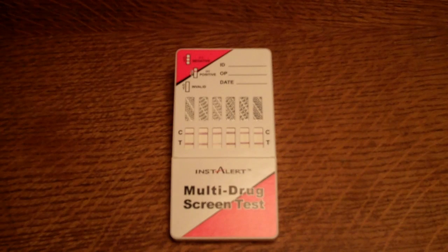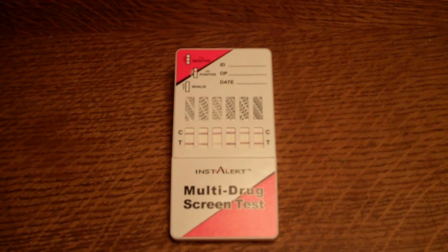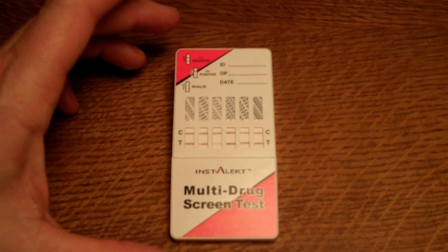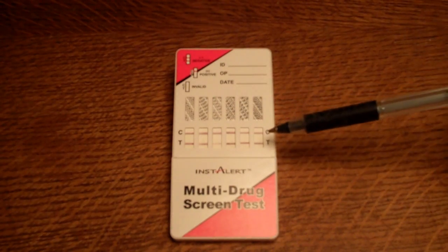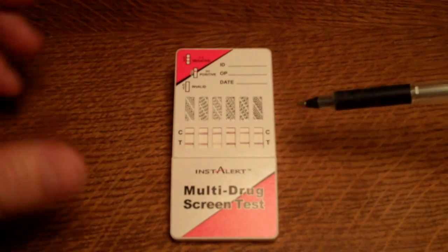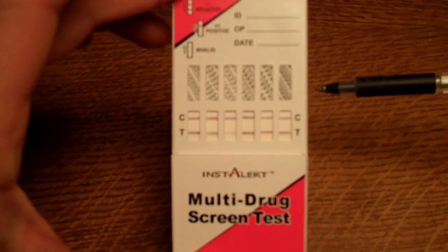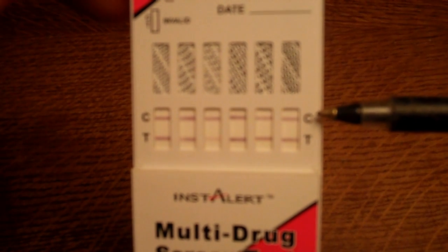In this video we're going to give you instructions on how to read the results on a multi-panel drug test. This covers a very common question we're asked regarding the interpretation of the test line showing following tests done in the field. This panel is a very good example of the variation you get on test line formation between different test parameters. You can see that all these windows are showing clear control lines — bringing it closer to the camera, the control line marked as C is showing pretty evenly across all the parameters.